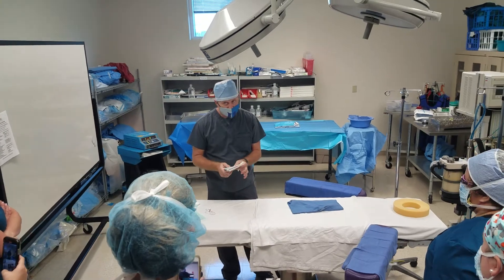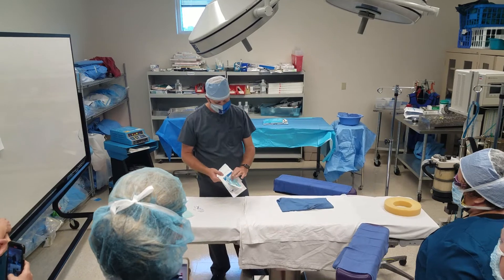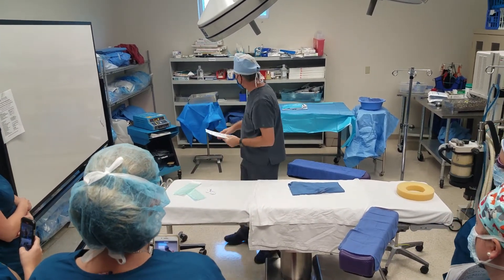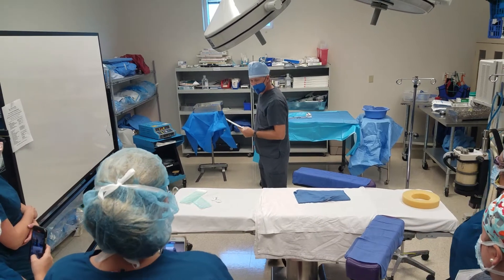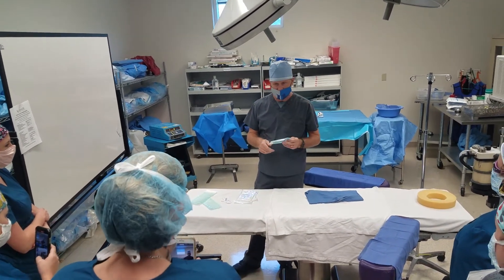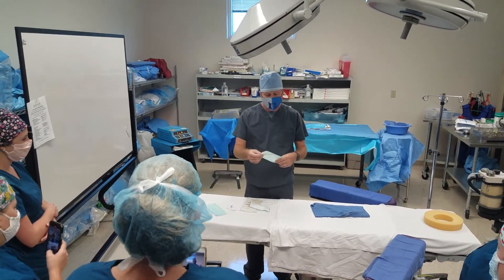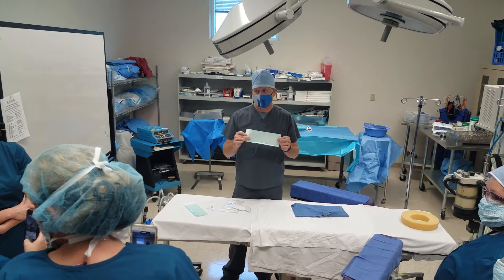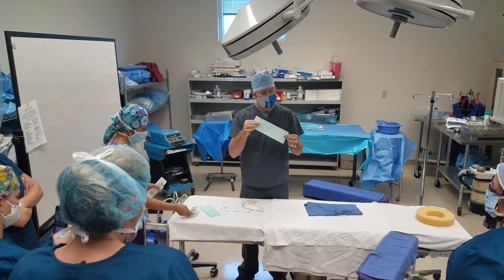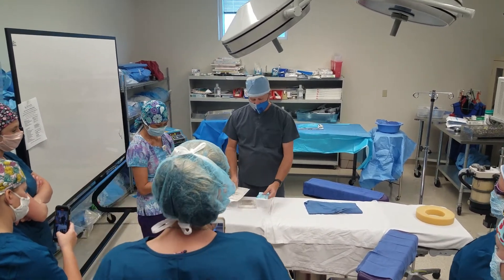We're going to start really simple. Most things that we open are going to be peel packed. These are examples of peel packs — it's not the only way to wrap things, but gloves and many disposables will come in a peel pack, meaning you peel it open. Your sutures are going to be in a peel pack too. These can be opened in the OR, and down in SPD they put things in them and create peel packs there. A lot of manufactured goods come already peel packed.